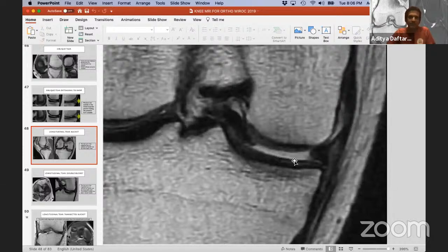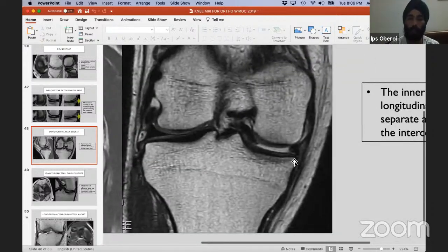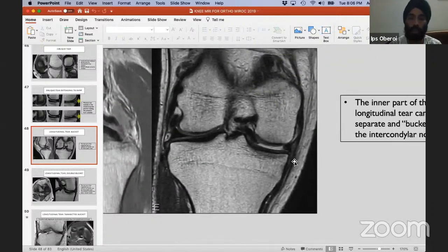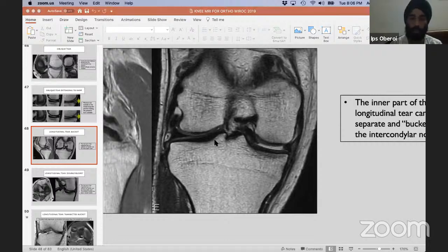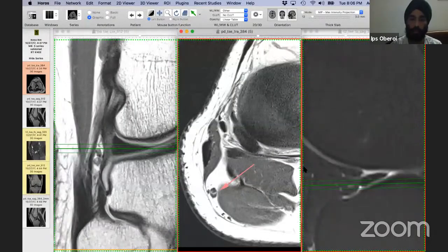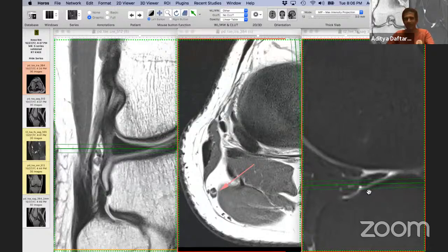Perfect. And how sensitive is the ramp diagnosis on an MRI? What we talk about when we talk about ramp lesions is, if you just see one slice on which there's disruption of those fibers, then you're not going to get very excited about it.